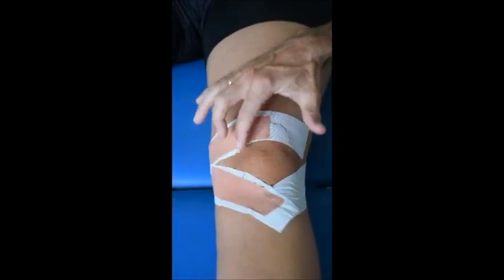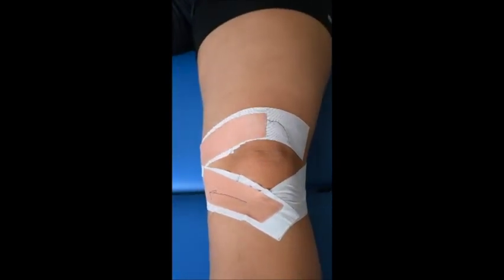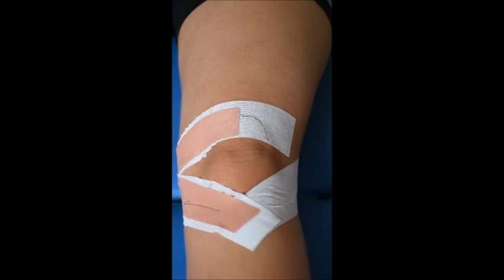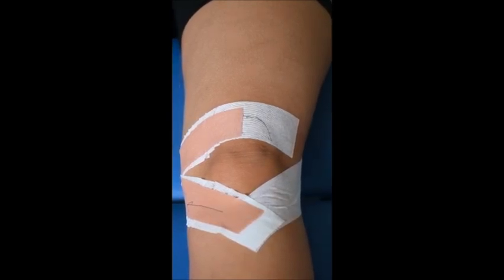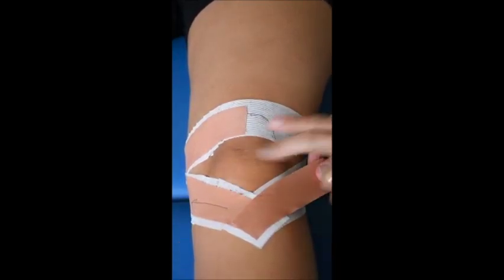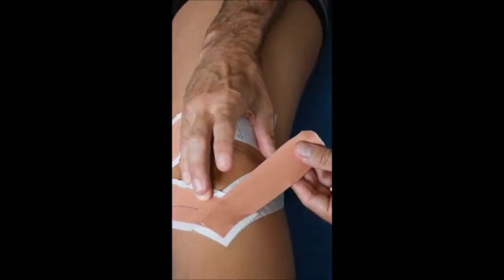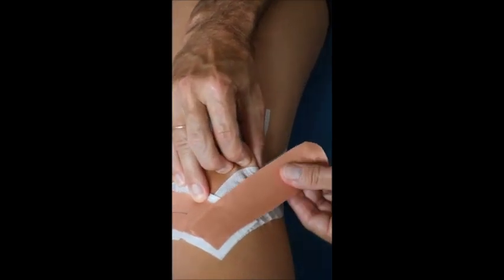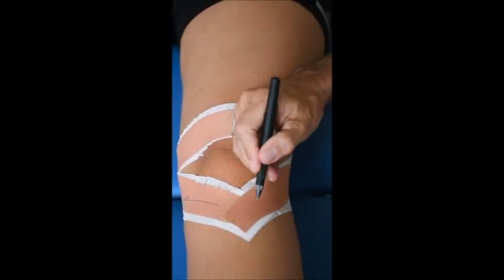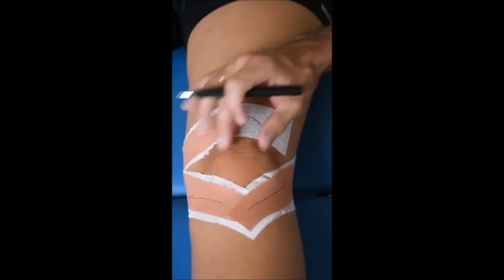So this would be for the medial side. And now the lateral side in exactly the same way. We stick the tape once again over the tibial tuberosity, 2 fingers below the apex, and now again we try to do this. We approximate the tissue, we lift off Hoffa, and we stick the tape to the lateral side. So both tape are going in these 2 directions in order to unload the fat pad.